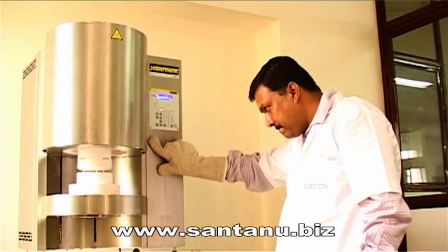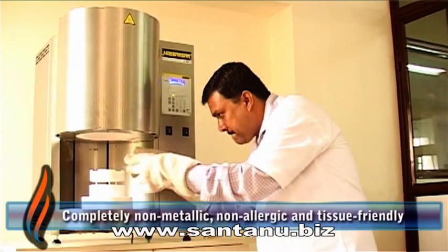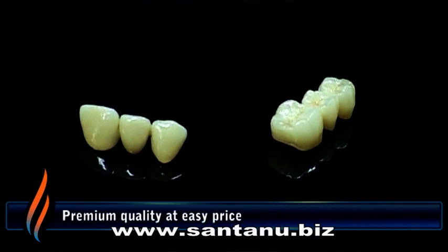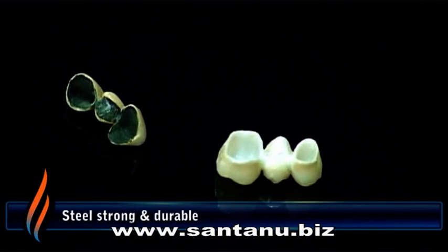The Zycon dental restoratives are highly biocompatible, completely non-metallic, non-allergic and tissue friendly. Available at an easy price, they are of premium quality with steel strong endurance and high durability.